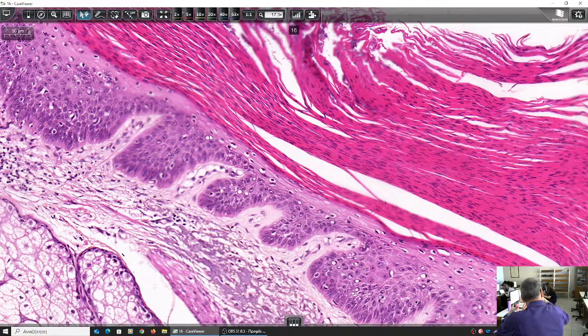This is pre-invasive neoplasia. That means if you leave it and don't excise it, it may become malignant, it may invade, and if all cancers were diagnosed at this stage, no metastasis would ever occur. Why? Because there is no invasion. Okay, I'll help you. Please have a look at your notes on the lesson of neoplasia. I want you to find this because it is very important in pathology.